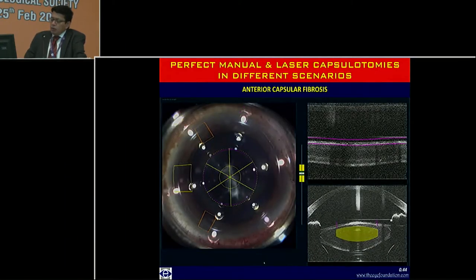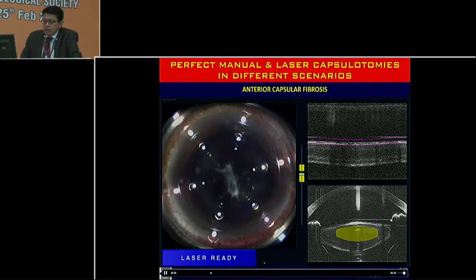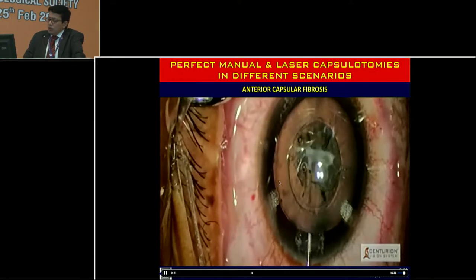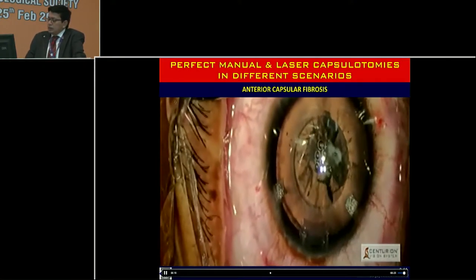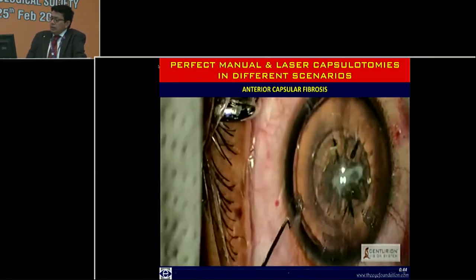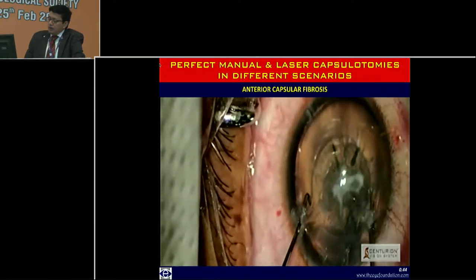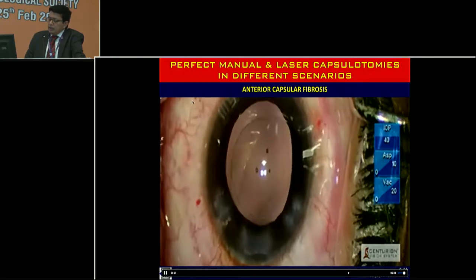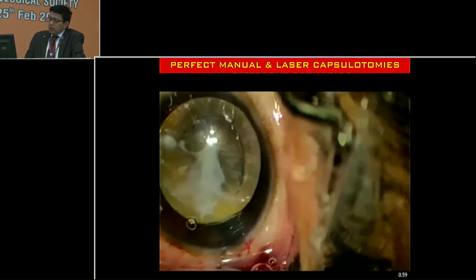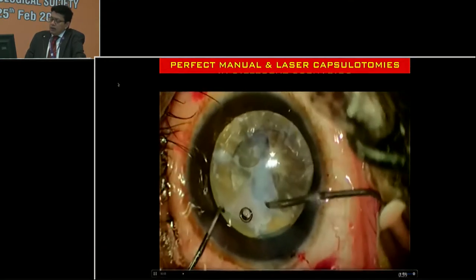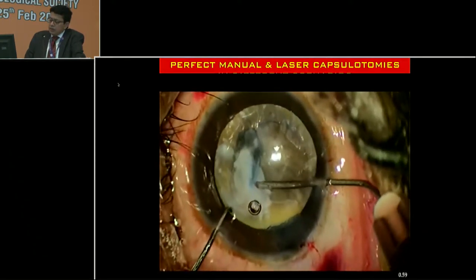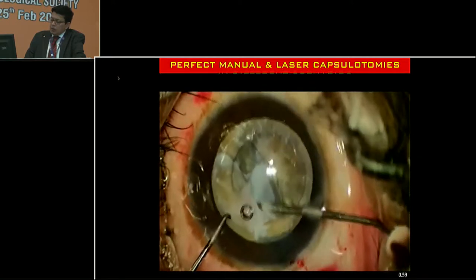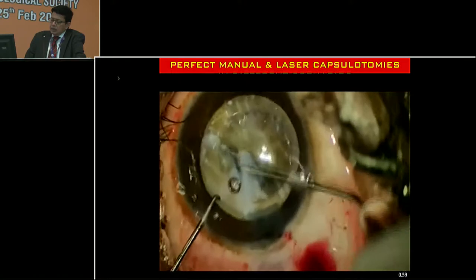What about anterior capsule fibrosis? We all know it is challenging to create a rhexis. In these cases, just surround the area of fibrosis, being aware that it may not be free-floating. If there's a single area of attachment, go in again with a needle to free that area. For a more difficult situation with a fairly large fibrotic band, the laser does not cut through it. You can see the template that has been created, but the 26-gauge needle approach could cause rhexis run-off — so, though it looks inelegant, use scissors to cut the strong area of adhesion, then remove the rhexis in total.